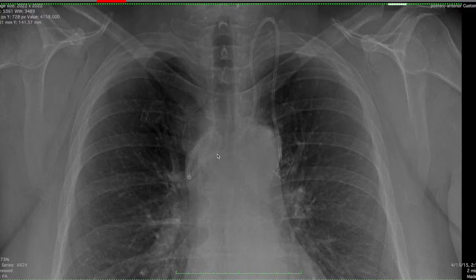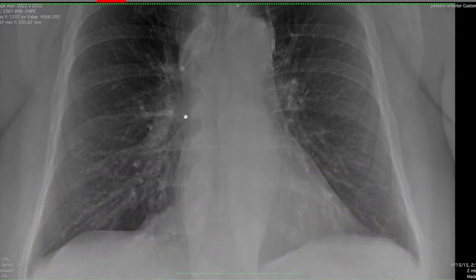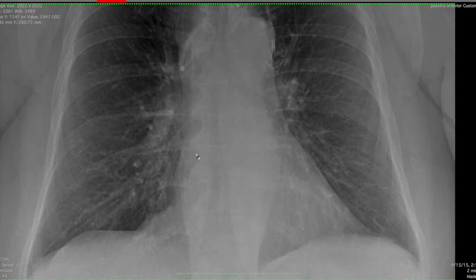Instead of coming down here after crossing midline through the brachiocephalic vein into the SVC, ideally these lines should be placed somewhere in the superior aspect of the right atrium, maybe the cavoatrial junction, but typically we see these in the superior aspect of the right atrium.